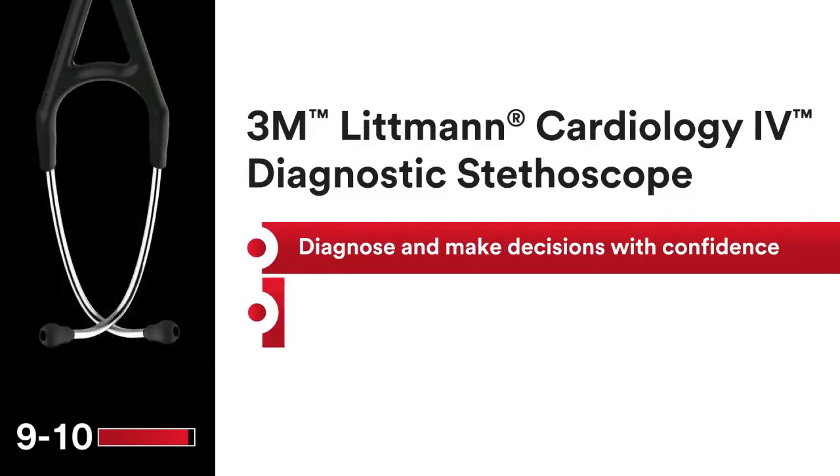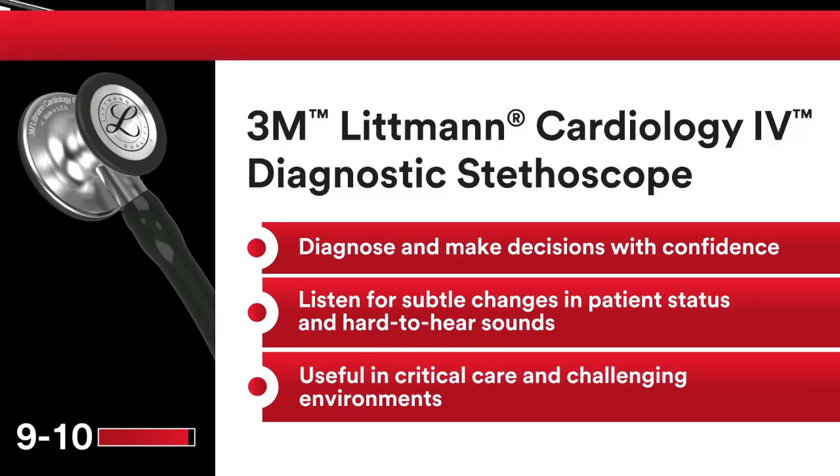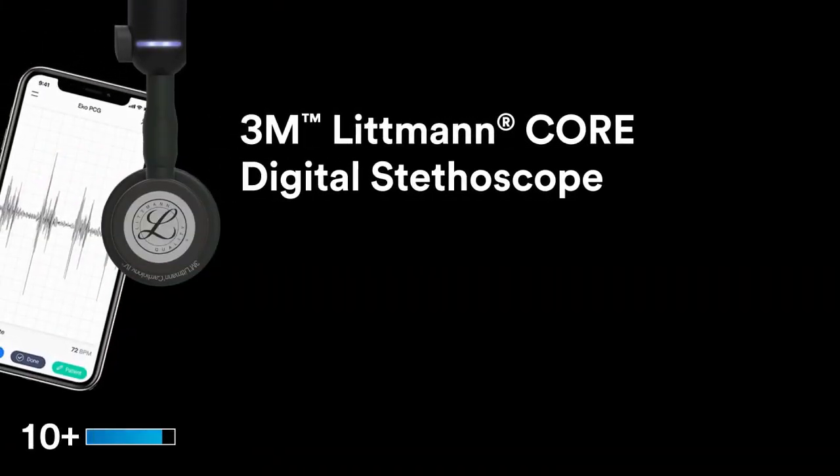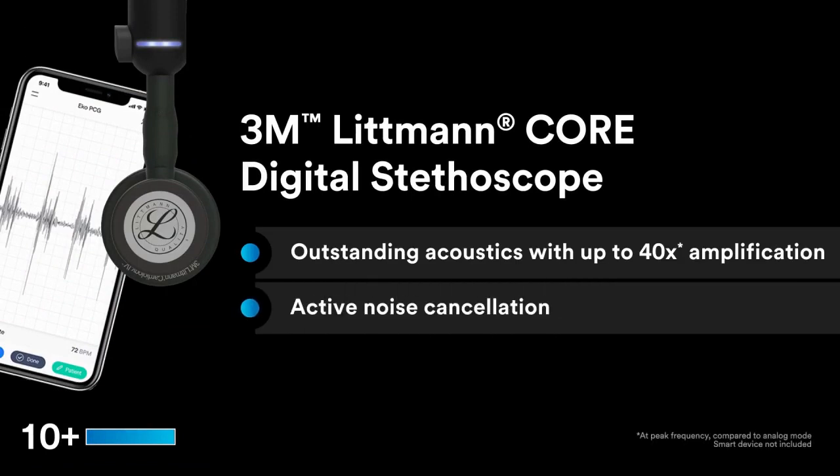5-year warranty. Fun and vibrant — match color and finish to your personality. Designed for use with adult and pediatric patients. Tunable, dual-sided stainless steel chestpiece with open or closed bell. Non-chill bell sleeve for greater patient comfort.